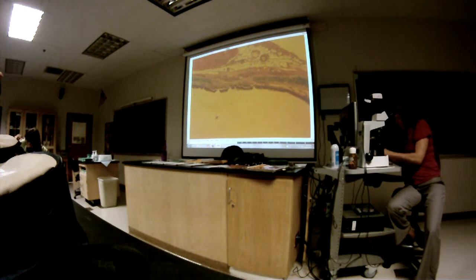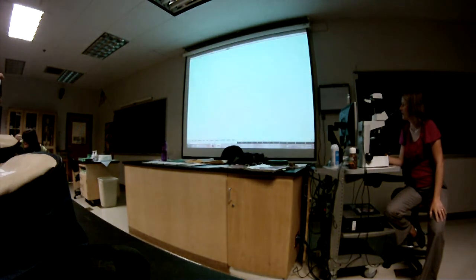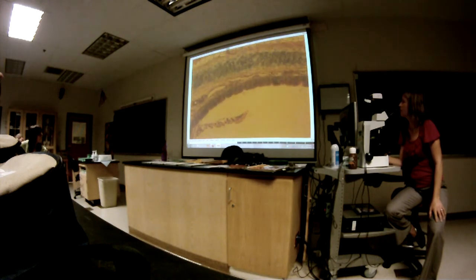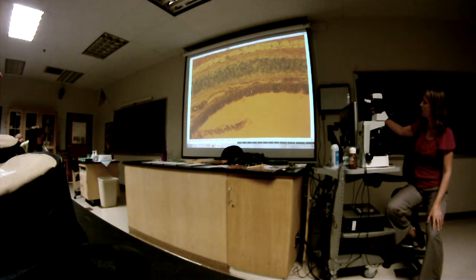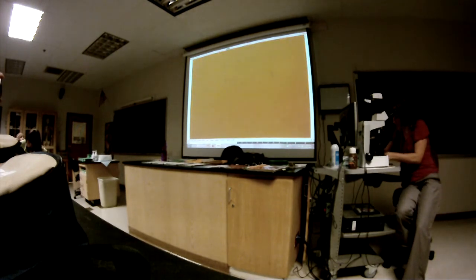And what else is on your list there? The pseudostratified ciliated columnar. Yeah, so that's the epithelial lining. So if you're in the front, you can probably see the cilia. Those of you in the back, maybe not, but here's the cilia, lots of nuclei. That's the pseudostratified ciliated columnar. There's the hyaline cartilage. All right, let's move on so we can get that last one up here.